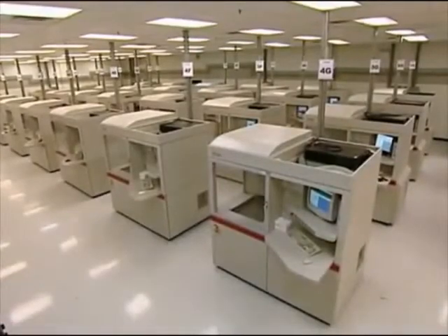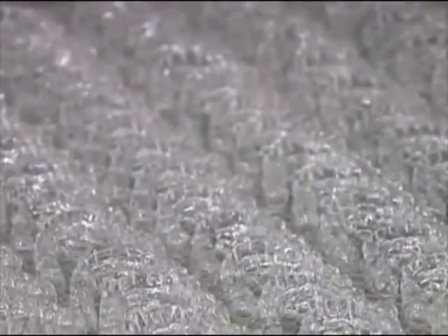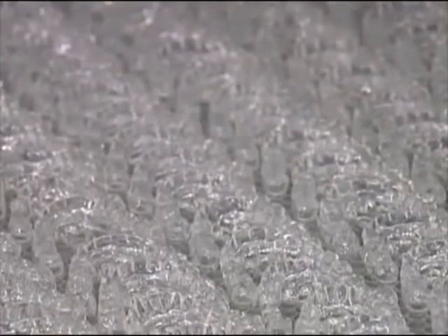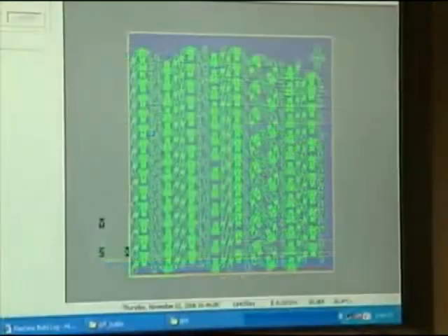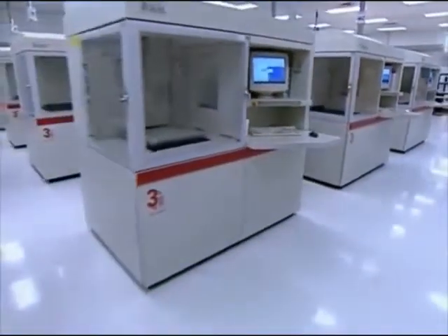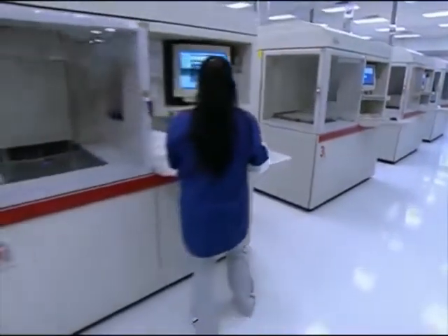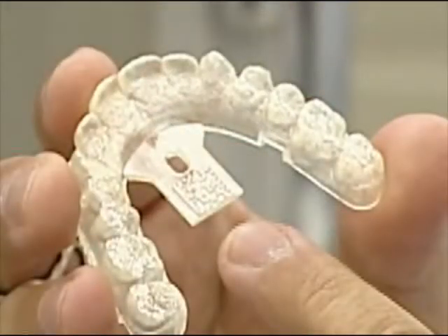The term SLA stands for stereolithography. SLA is a common process used in manufacturing prototype parts where a model is created. In many operations, they might build one part a week or one part a month, which is a big deal, until you realize that we're making over 40,000 parts a day in this particular process, making Align the world's largest single source user of this particular technology. To track those 40,000 parts a day, we put a two-dimensional data matrix label on each mold so that we can easily identify the patient the mold belongs to and where it fits into the sequence of aligners for that case.